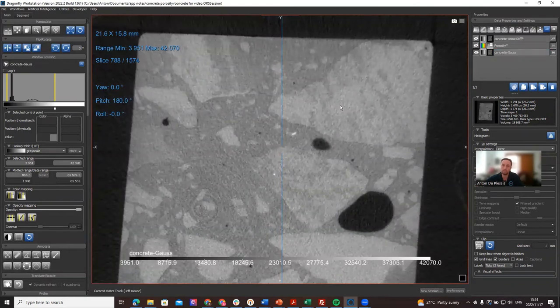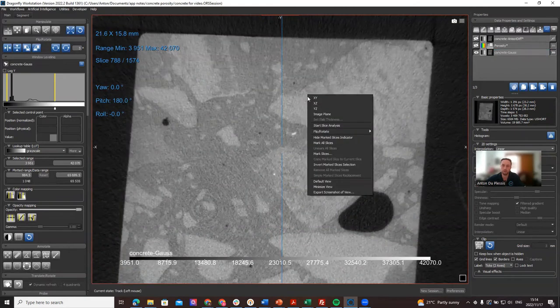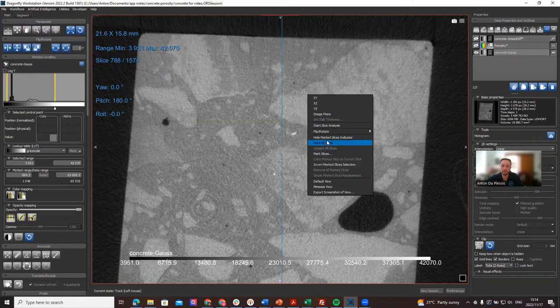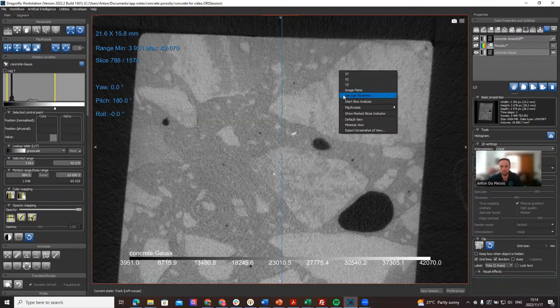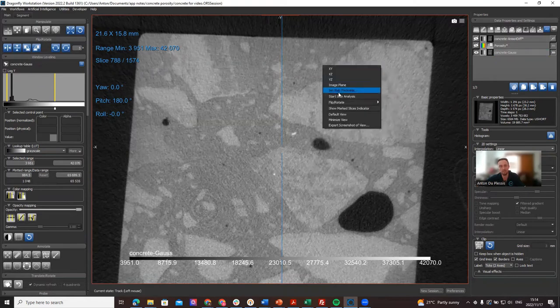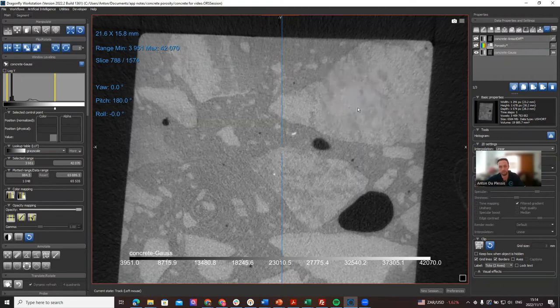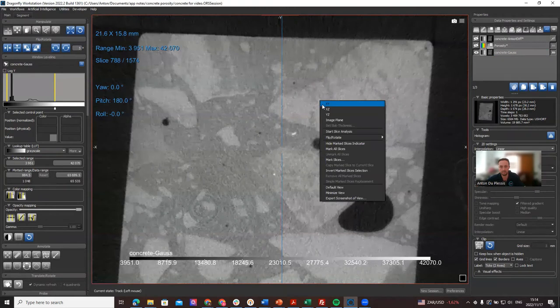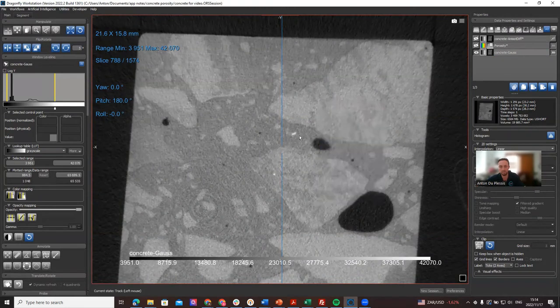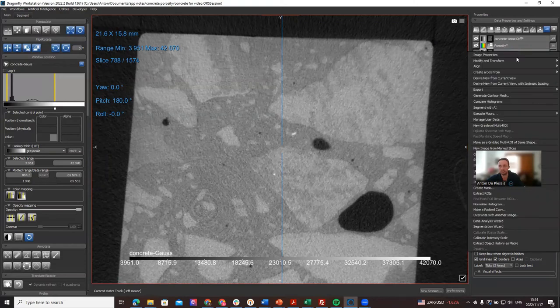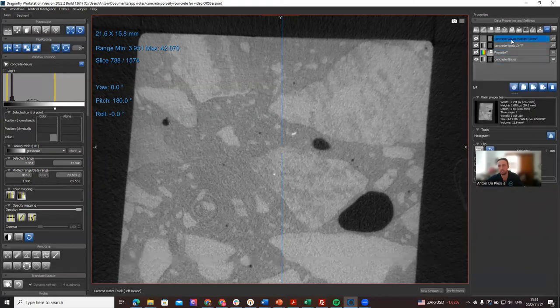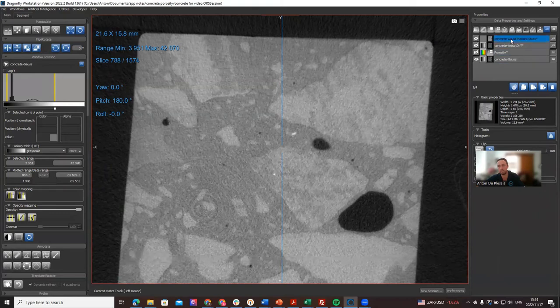If we have the original one active, what you do is you right-click on the image. Usually the marked slices won't be visualized, so let's start with show marked slices indicator. Nothing is marked yet, that's why it wouldn't be visible. What we need to do is click on this slice for example, and then on the image we can say new image from marked slices. This new item here is simply one specific image slice number 788.